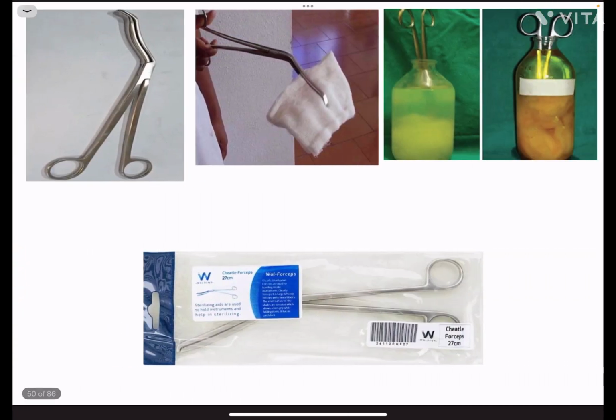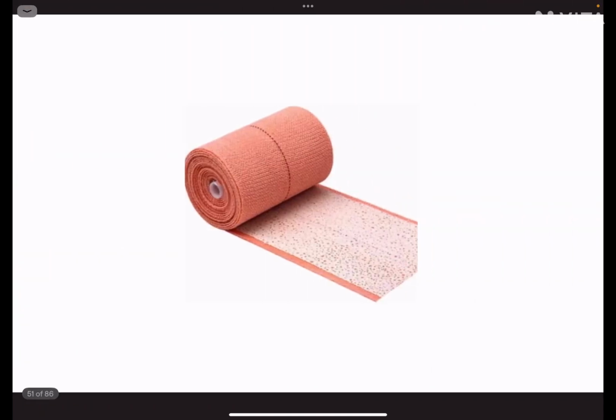We have already discussed about Cheetle's forceps. Now in adhesive surgical tapes, the dynaplast or elastoplast are important. They are stretchable tapes which have adhesive, that is zinc oxide, which is whitish in color. And what is the use of this elastoplast? It is used for strapping around joints. It is also used for strapping in case of fracture, for the immobilization of the fractured segment. It holds the dressing or the bandages over the wounds.